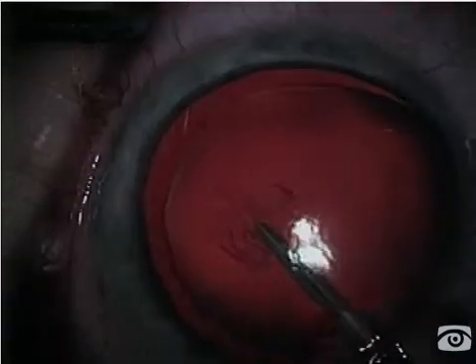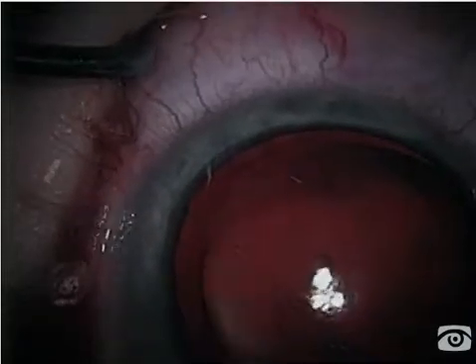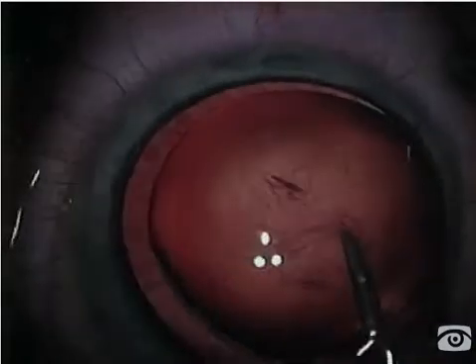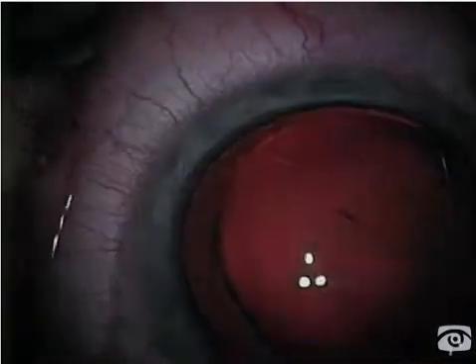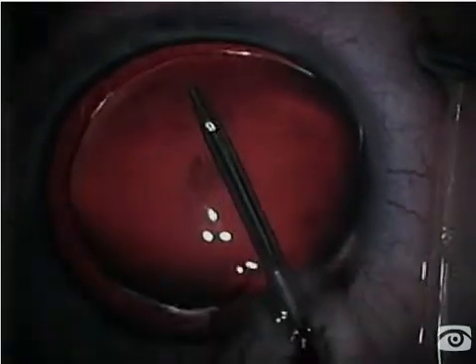I'm aiming to keep it on the small side, since with the lack of zonular tension, this flap really wants to slingshot out radially, and it's very important to complete an intact capsulorexis in these cases.